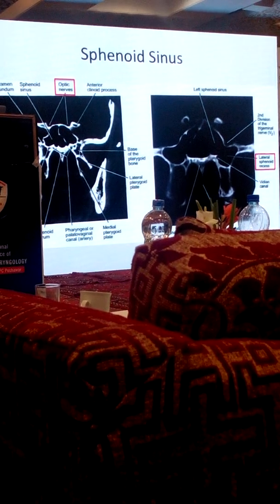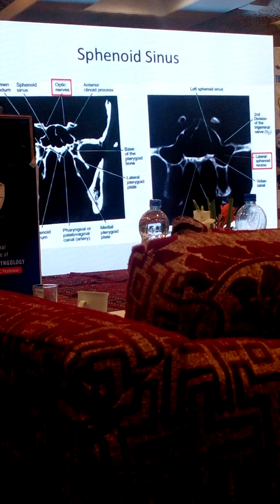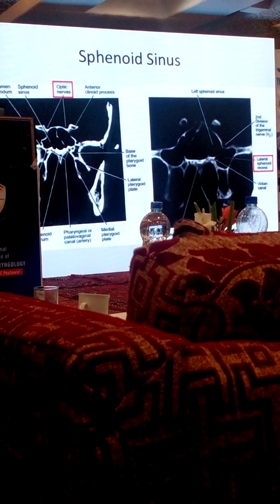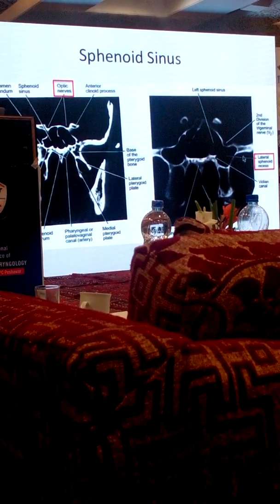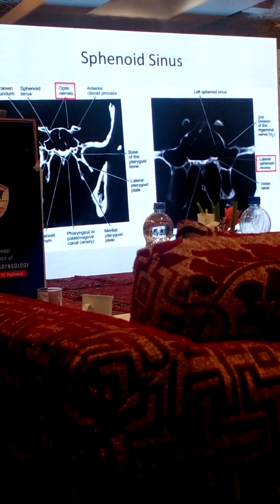So this is sometimes pneumatized. What is this? Root of the pterygoid. It may be pneumatized. Sphenoid may pneumatize into the greater wing, sphenoid may pneumatize into the lesser wing. It may go into the clivus. This is the lateral extension going into this. No pneumatization over there. This we are in the nasopharynx now.